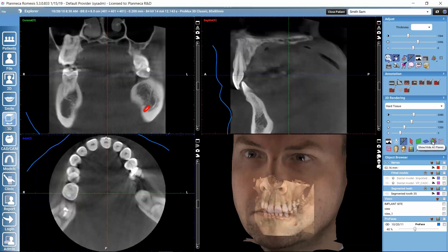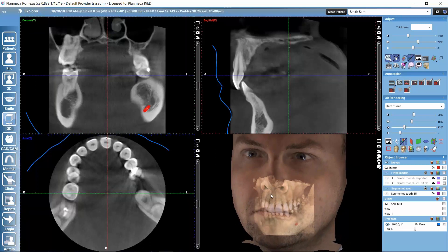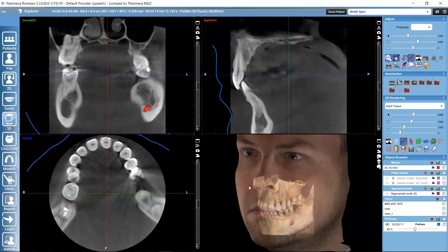This view can help us understand our data better — for example, by activating the planes in the view we can understand from where the slice views are taken in the volume. We can also use this for patient education, with a 3D facial photo overlaid on top of the CBCT data for a more natural representation. We can also plan treatment, add a nerve, dental models, implants, and build a virtual patient with all the information in one view.